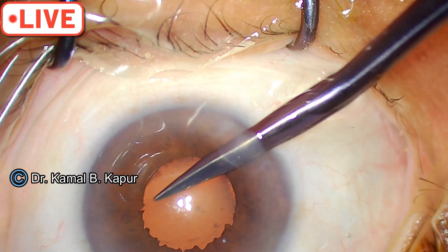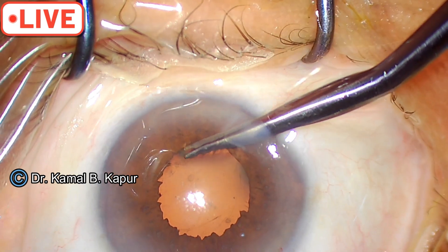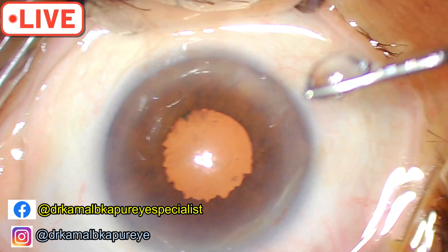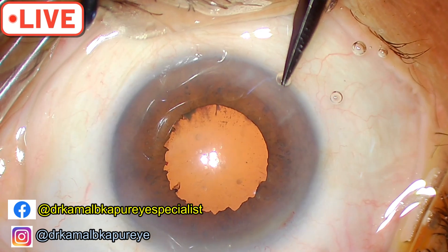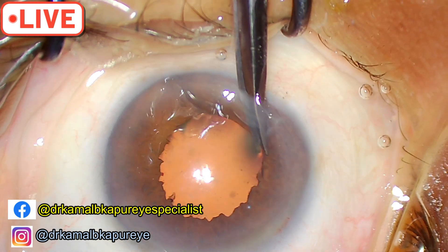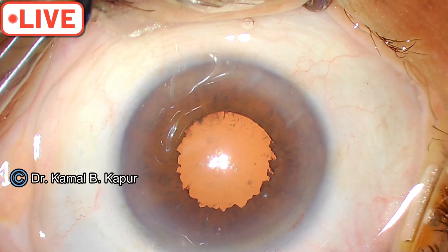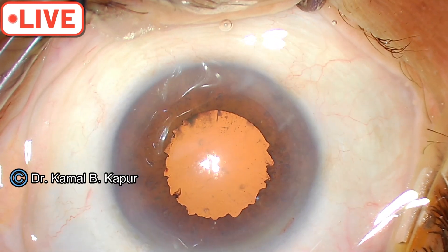Don't be over-eager and give a larger bite because then you will have a disfigured pupil. The trick is to create very very small sphincter openings. Keep refilling the anterior chamber. You can nearly do a 360-degree sphincterotomy with this technique, and the pupil will remain beautifully round the next morning.